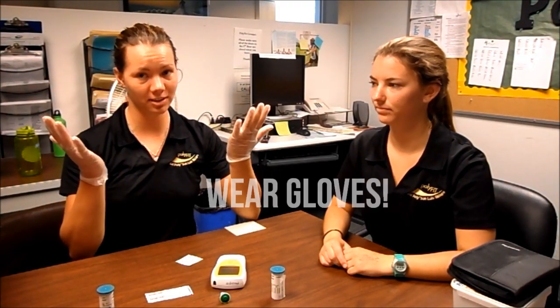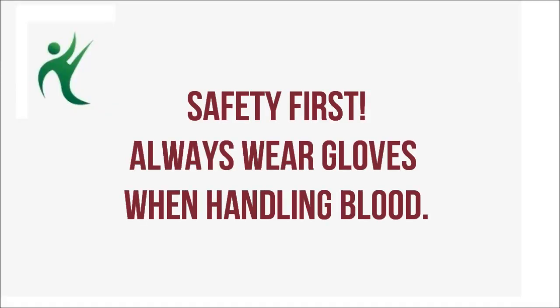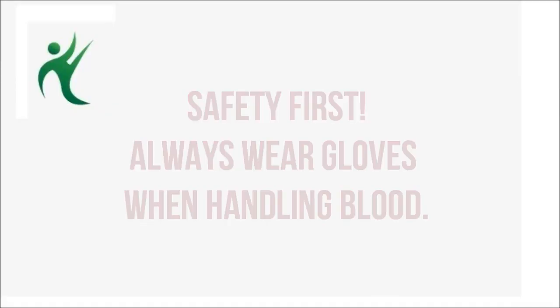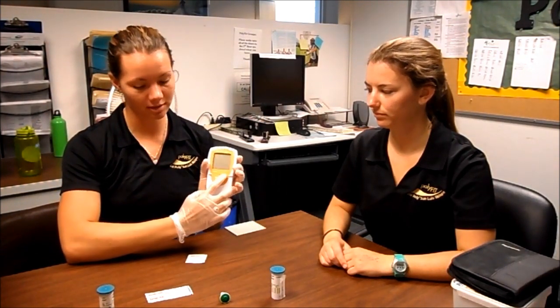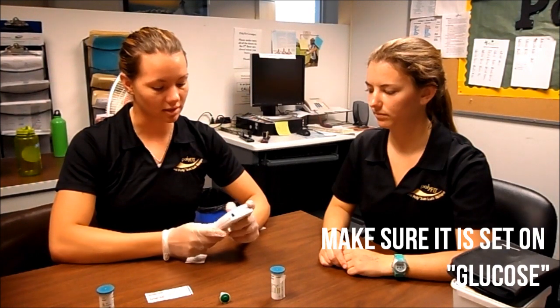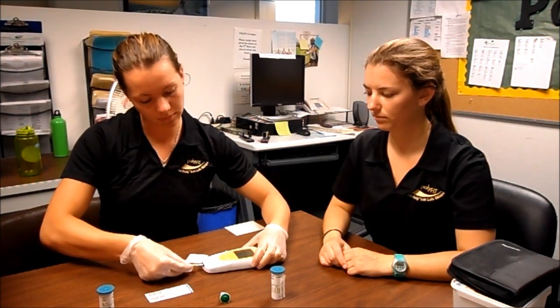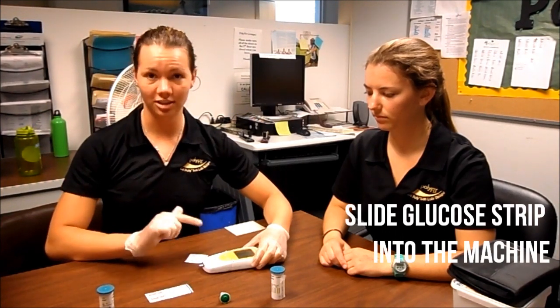Next is our glucose and cholesterol testing. Before you start testing, make sure you wear your gloves as a universal precaution. Turn on your glucose and cholesterol machine and make sure it is set to glucose. Slide the glucose strip in — you should hear it beep twice.